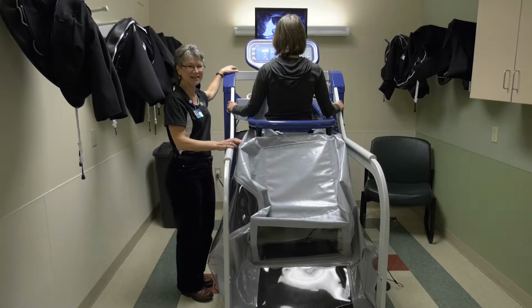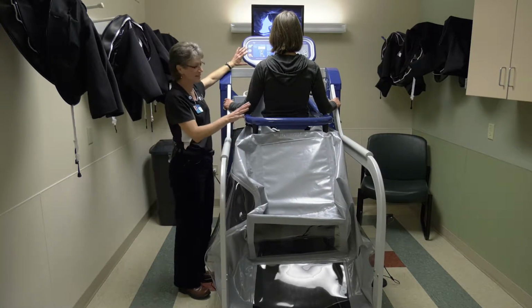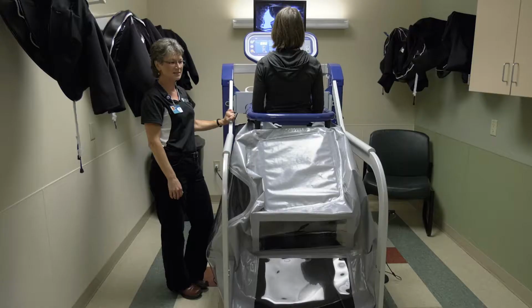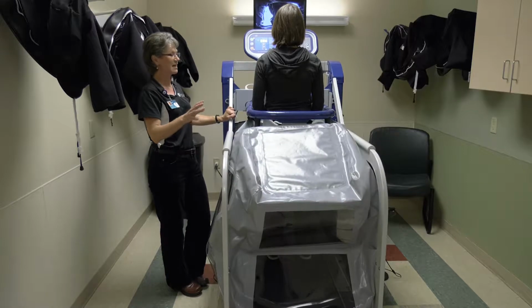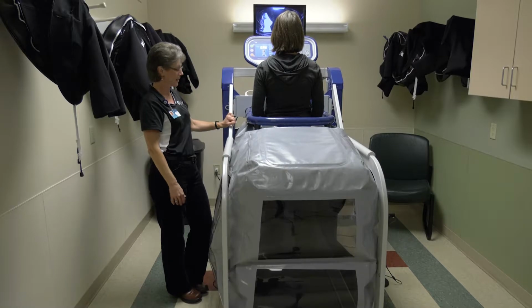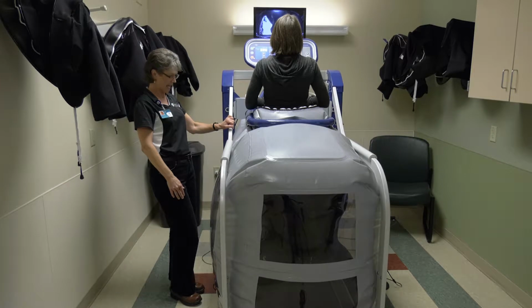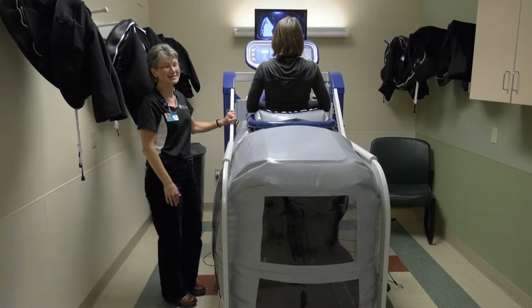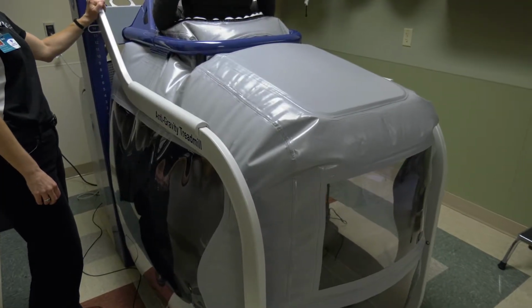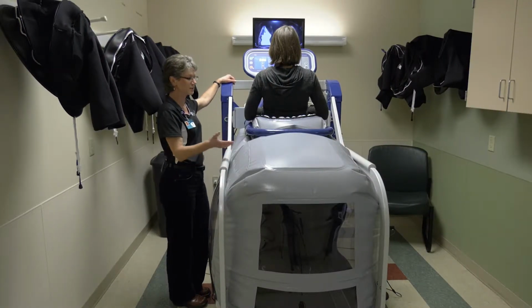So now we have Courtney in the cockpit, and we're going to inflate the machine, and she's very safe. So we're going to start the machine, and it's going to calibrate her weight so that when we tell it how much weight we want to take off, we can do that. So it takes a minute to do that. And if you look at her feet, it's going to lift her right off. And it's going to do that 2 times. And it does not tell us how much she weighs. And then once we have it calibrated, it functions just like a normal treadmill. And then it's going to deflate, and we'll start from scratch.